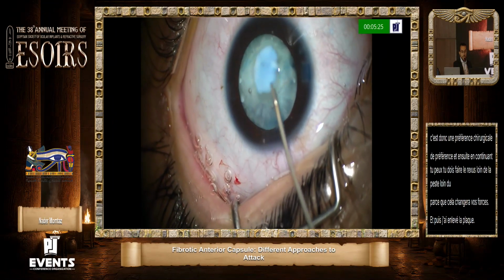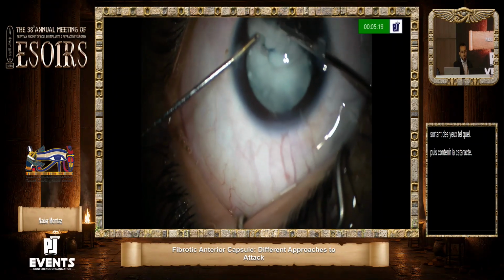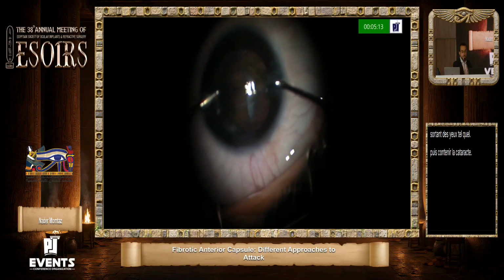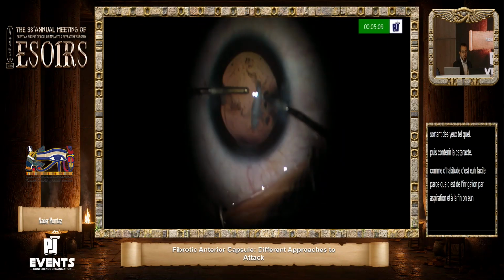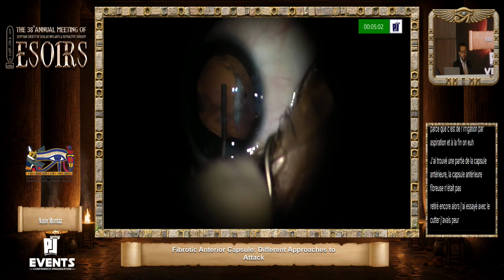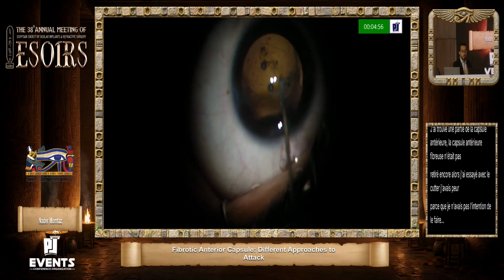going out of the eye as it is, and then continuing the cataract as usual. It's easy because it's irrigation aspiration. And at the end, I found a part of the anterior capsule. The fibrotic anterior capsule was not removed yet, so I tried with the cutter. I was afraid because I was not aiming to open the posterior capsule again. That was a 15-year-old boy.